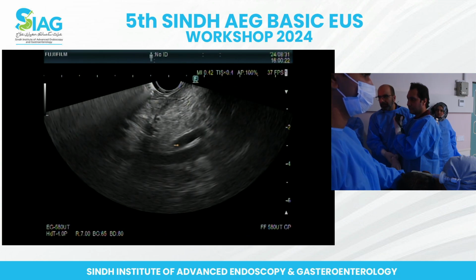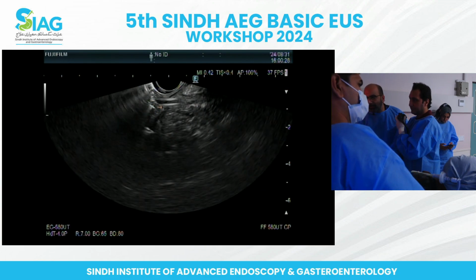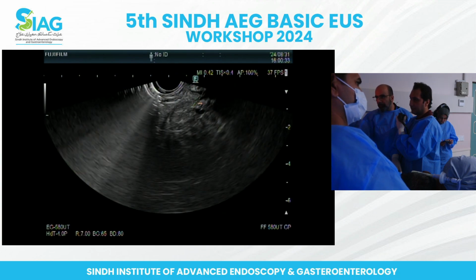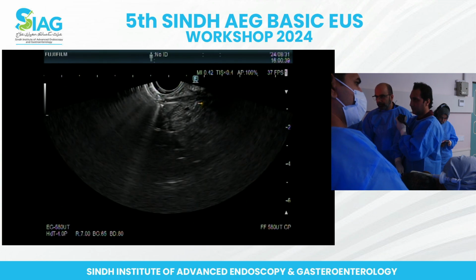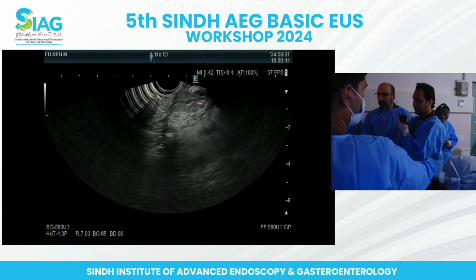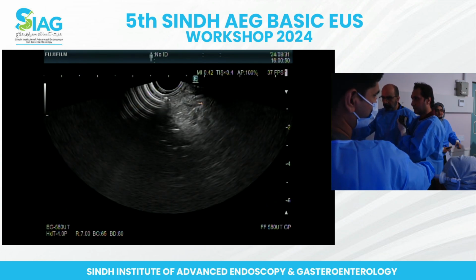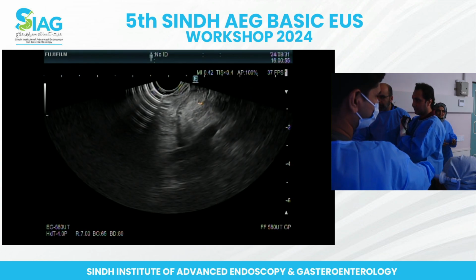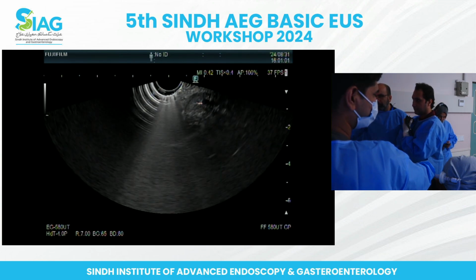So here you can see the stent entering right there. The stent is entering the duodenal wall. So we're not seeing an obvious lesion here, but you may just need to pull back a tiny bit more. Good, keep pulling back. And just spin around, clockwise, counterclockwise. See if you see anything. More. Your range of motion needs to be a bit more. The PD, nothing really there. Go the other way now.